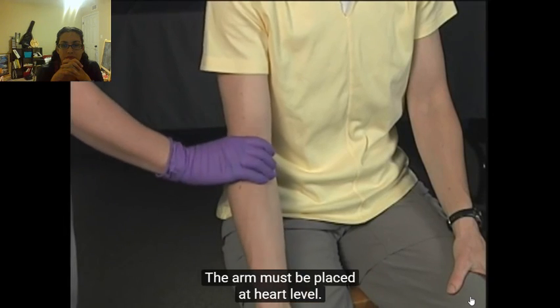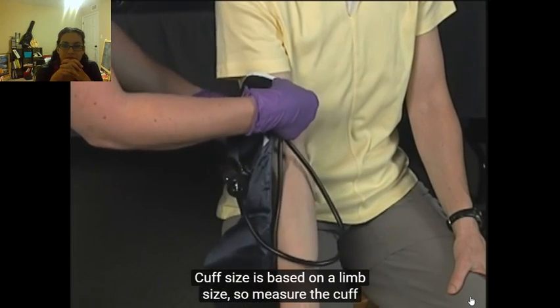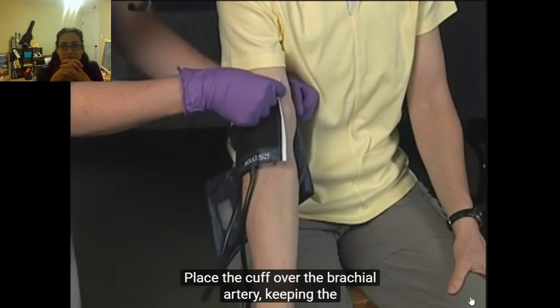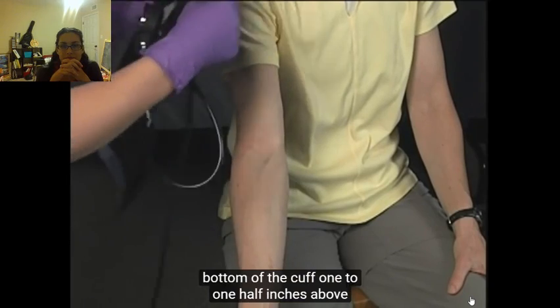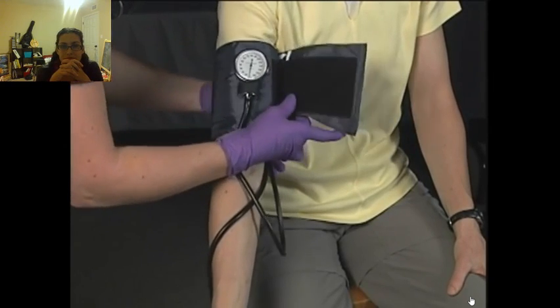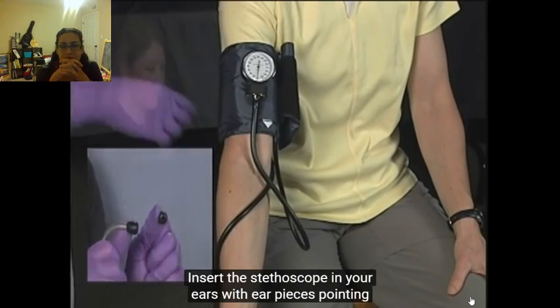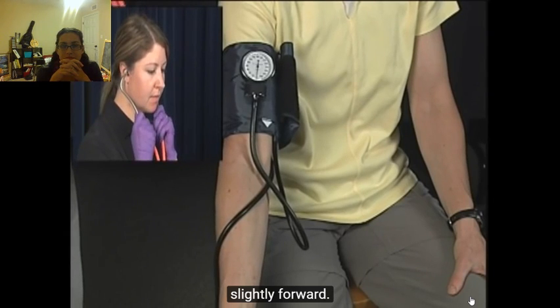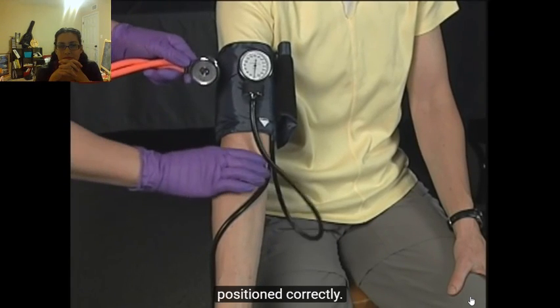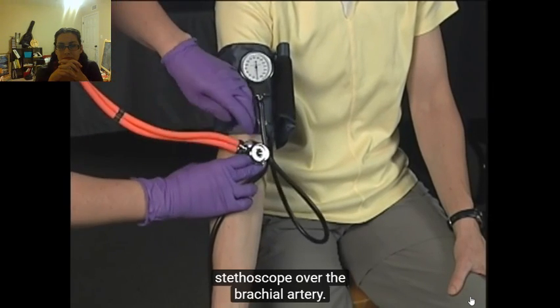The arm must be placed at heart level. Cuff size is based on limb size, so measure the cuff appropriately. Place the cuff over the brachial artery, keeping the bottom of the cuff 1 to 1.5 inches above the bend in the elbow. Insert the stethoscope in your ears with earpieces pointing slightly forward. Gently tap on the diaphragm to assure the stethoscope is positioned correctly. Palpate the brachial artery and place the bell of the stethoscope over the brachial artery.